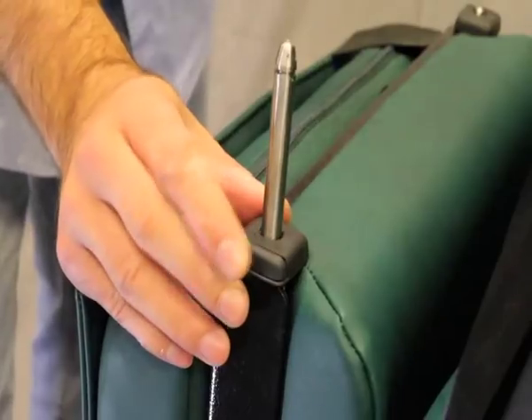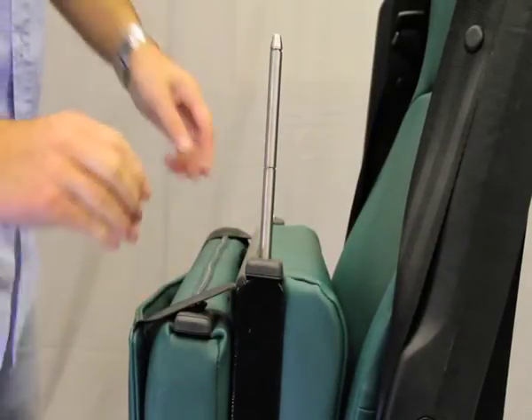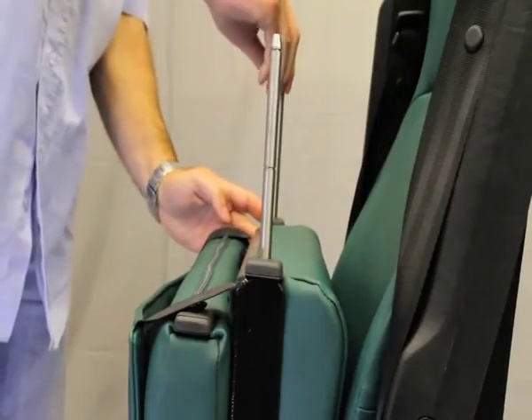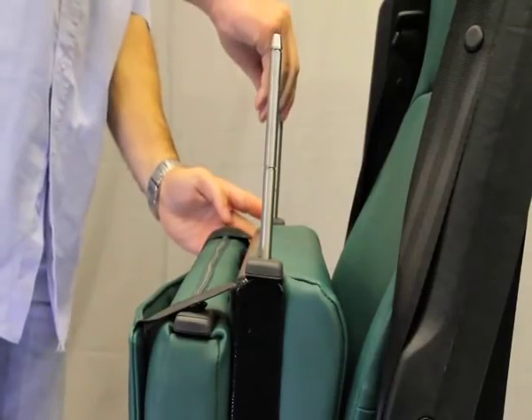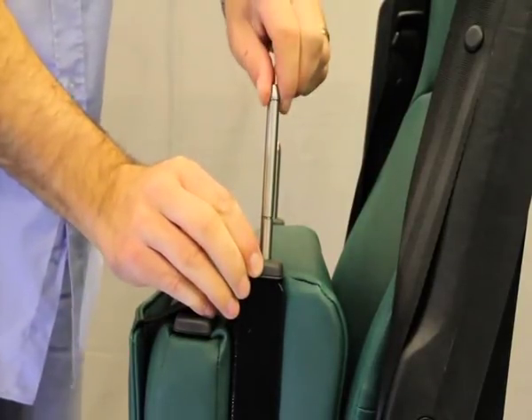Squeeze the catch to release the extension stalks. Holding the catch, slowly pull up the stalks until they are fully extended. Squeeze the catch and adjust the stalk downwards to engage into the first groove.